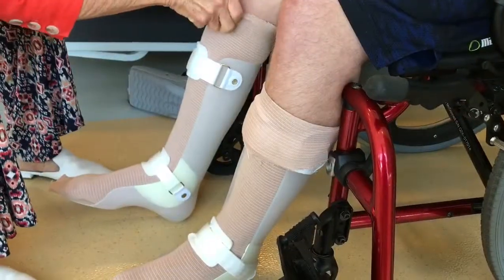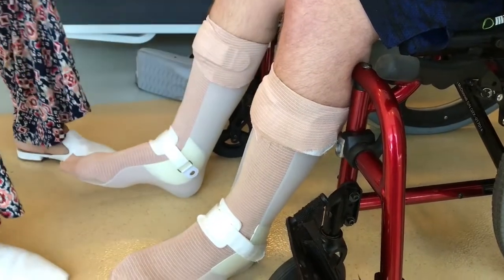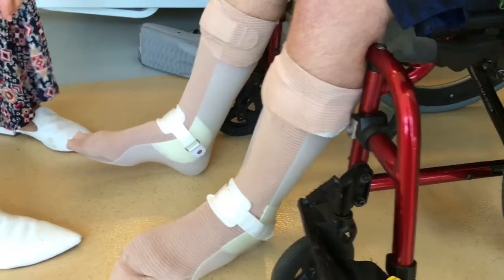But look how it looks. What we're looking for is any areas of redness, or a dark change in color, or color transferred to your sock or something to that effect.